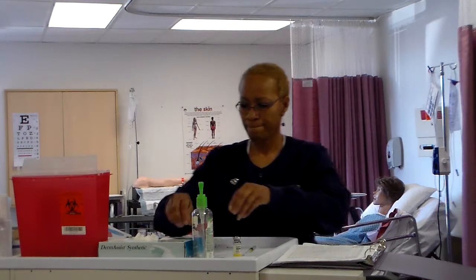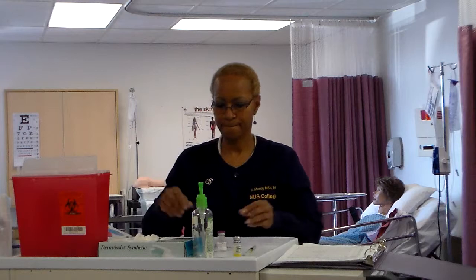Vial containing a powder. Reconstituting medications. Now this is fun. I remember when I was going to nursing school, I couldn't wait to get to this. I couldn't wait to get to reconstitution.